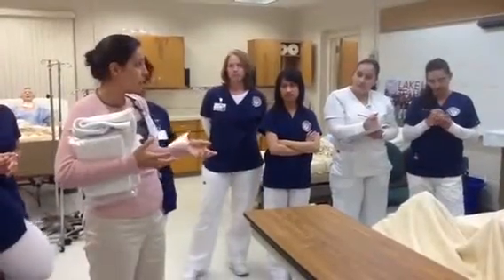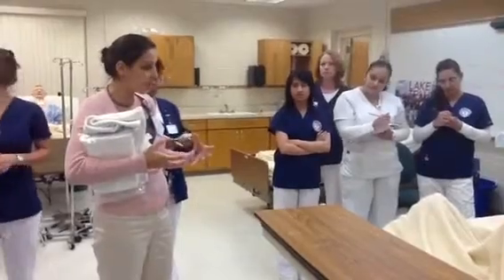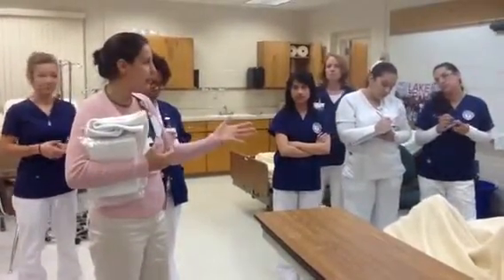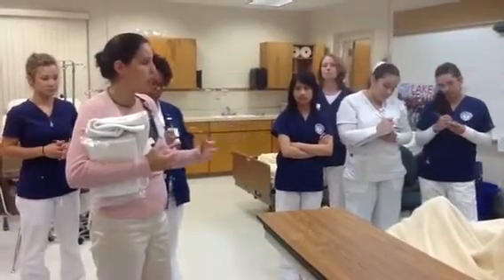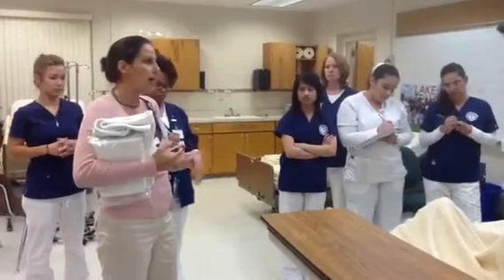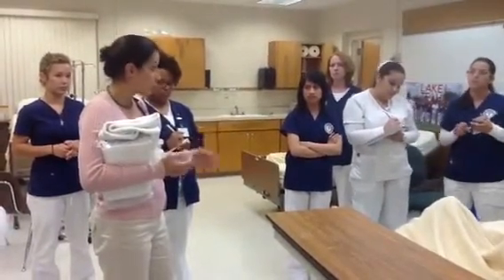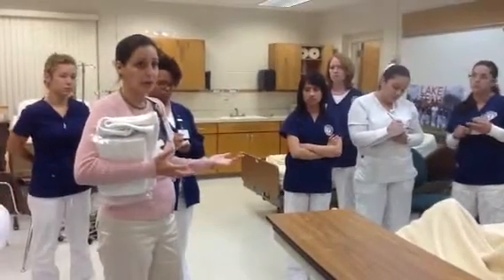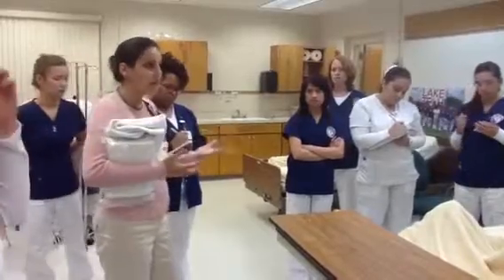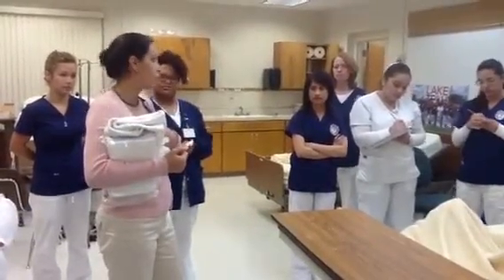The first thing that I'm going to do is check that I have an order for this particular procedure, and that along with the order, my patient has met the indication for this procedure. So if the order says place a Foley catheter after 8 hours post-op with no void, which means they weren't able to go to the bathroom after surgery, and we've done 8 hours of them trying, I need to put a catheter in. So my patient has met the criteria and I have an order.